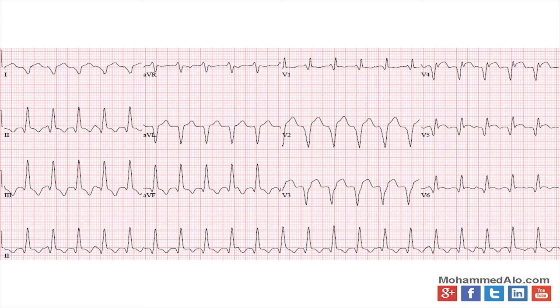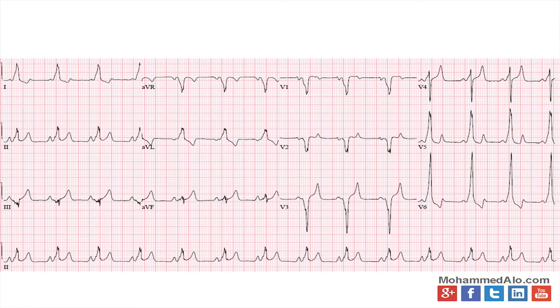I don't see a clear RS. There's no initial positive deflection. It all looks like it goes down, then up, if anything. In this case, I would say this is probably VTAC. You could use Brugada's criteria for VTAC and look at the actual shapes and decide if this is really VTAC or not.